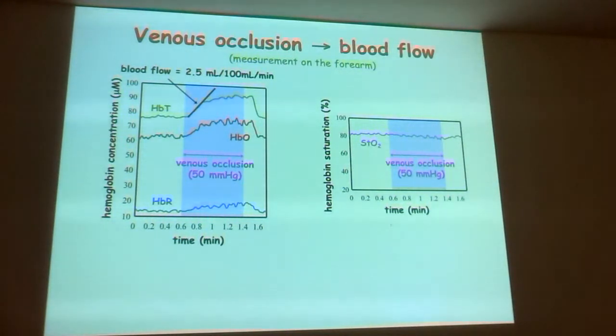And then what's interesting is you notice the slope comes up, but then it plateaus. So what's happening there? Why is that plateaued? Because of that buildup, and as flow drops, because it's filled up, and the veins can no longer expand, right? The pressure actually is increasing downstream. And so now at that point, blood is flowing out. So the blood is still flowing in, right, but it's also now beginning to flow out. At least I think that's what's happening.